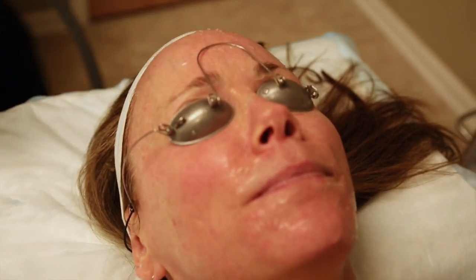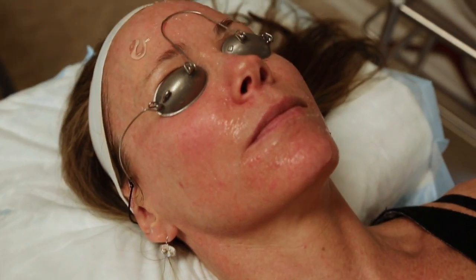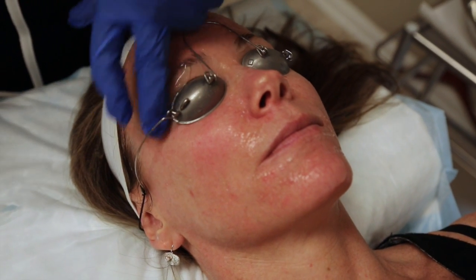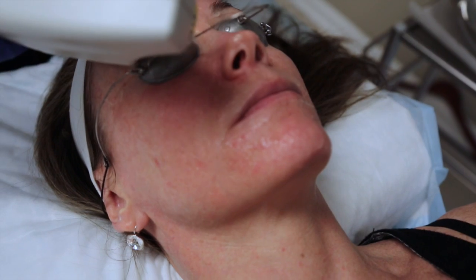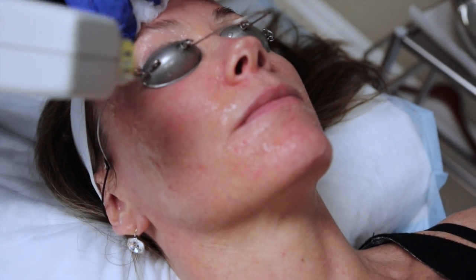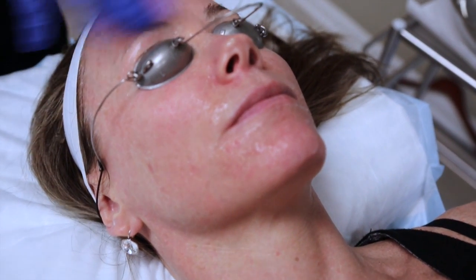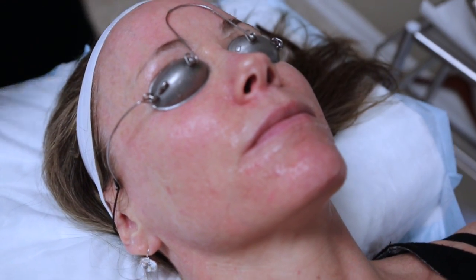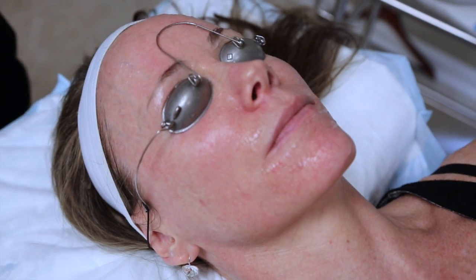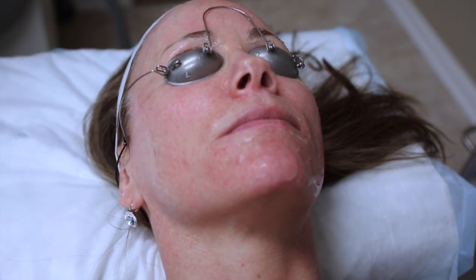Downtime with this procedure. Patients who have a lot of pigmentation will develop, the pigmented areas will get darker for about 7 to 10 days, and then they start looking like somebody ground pepper all over their faces, and gradually that peppered appearance fades every time they cleanse the skin. Okay, so this was the filter for brown. Now I'm going to record how many pulses I treated her with, and then I'm going to switch the filter.